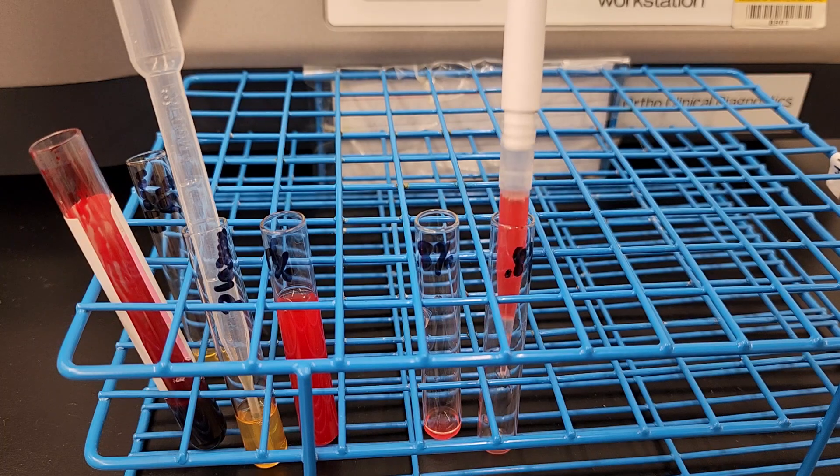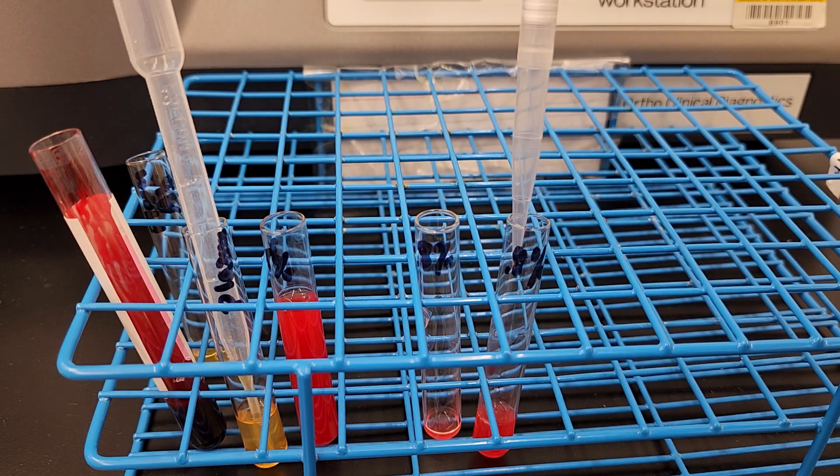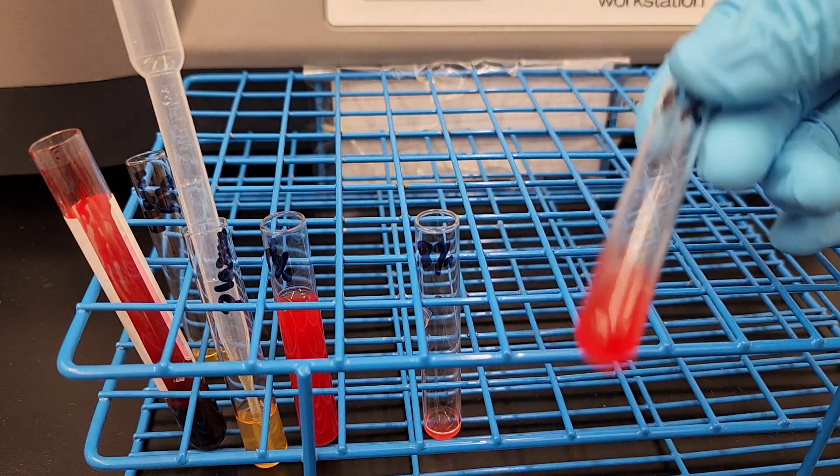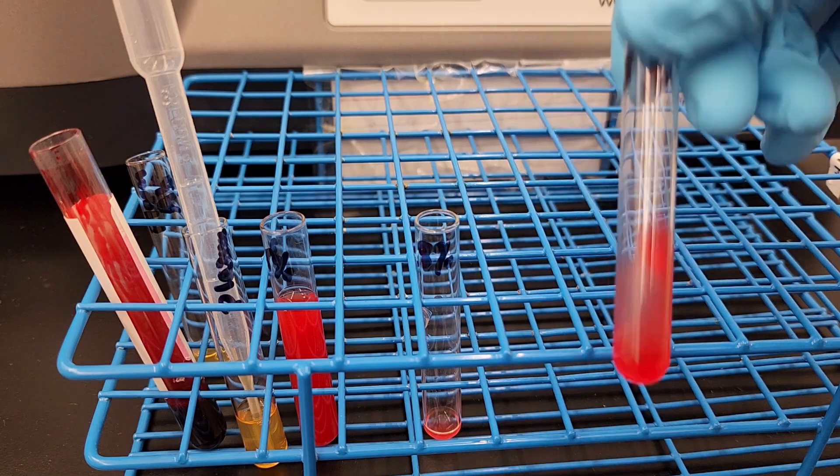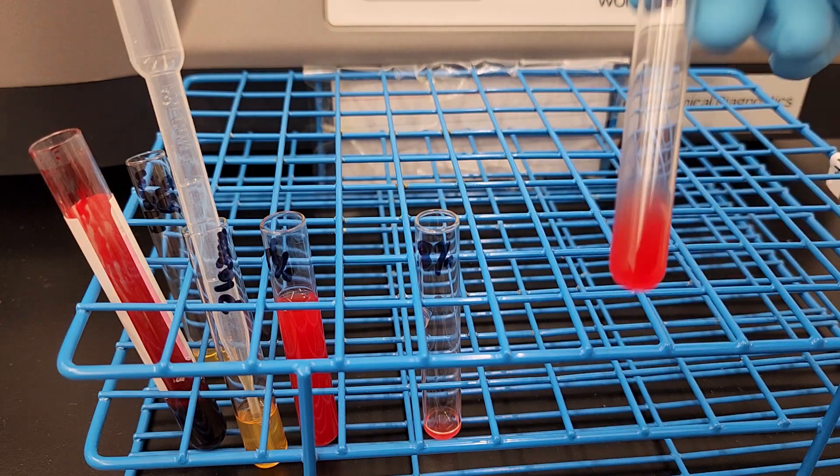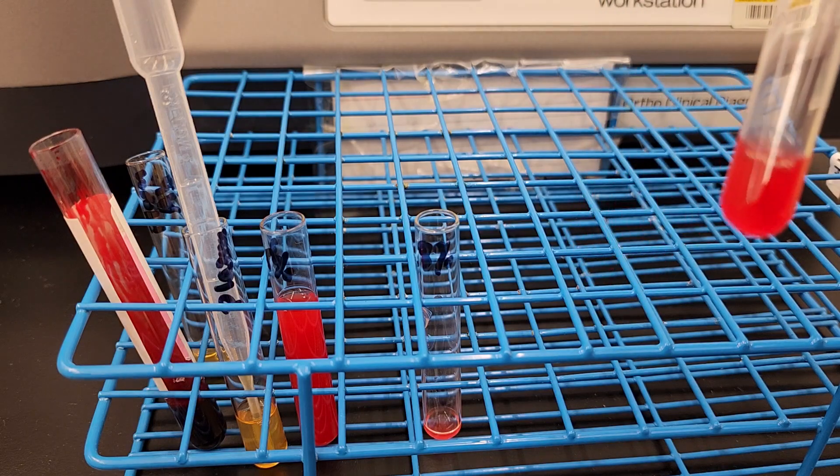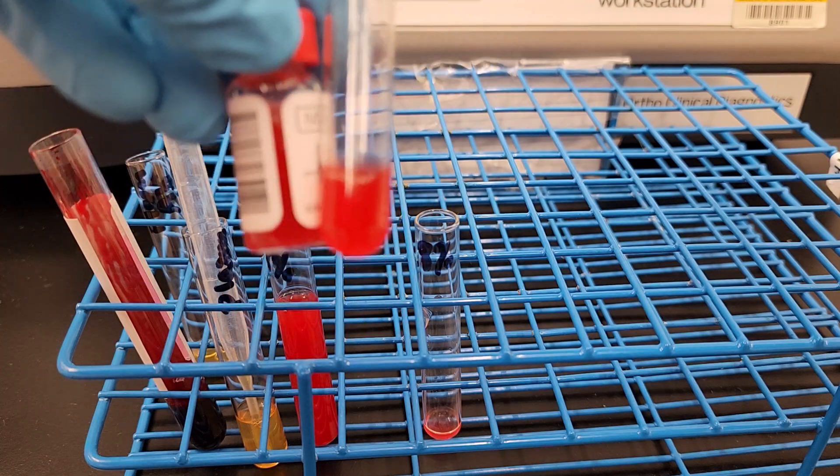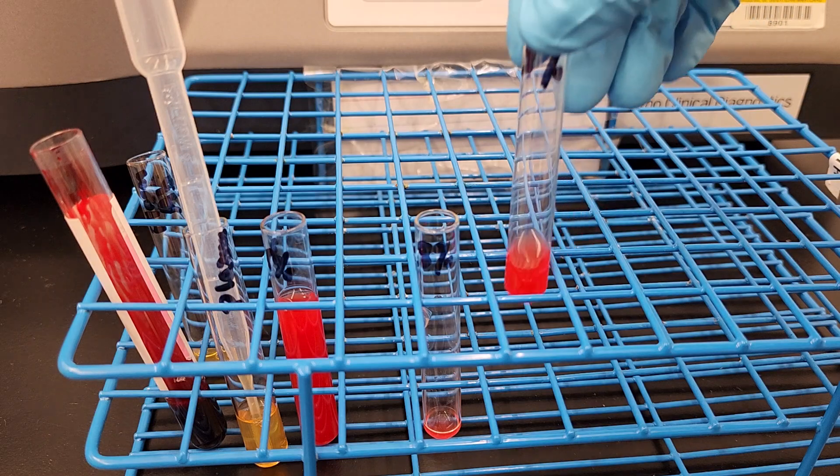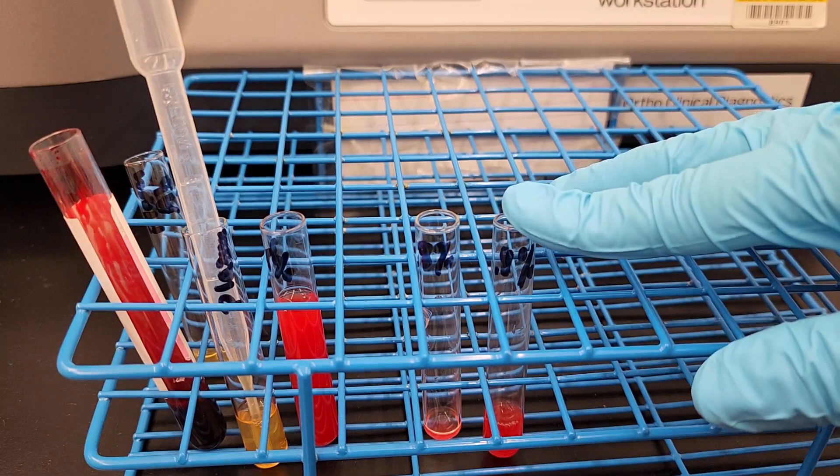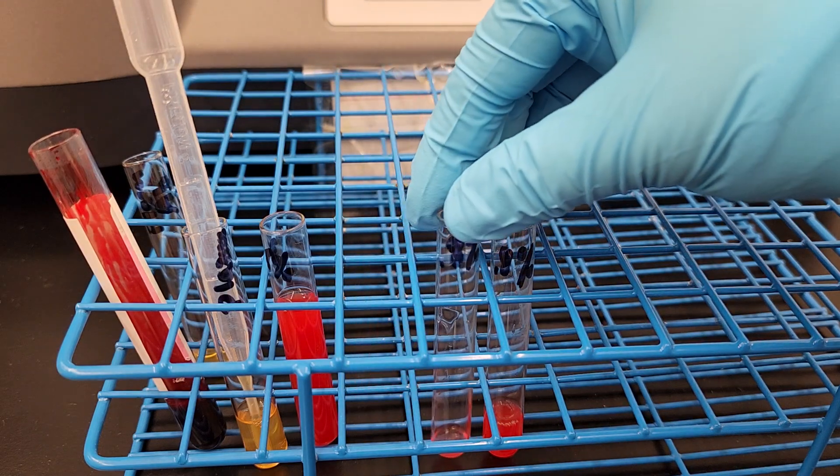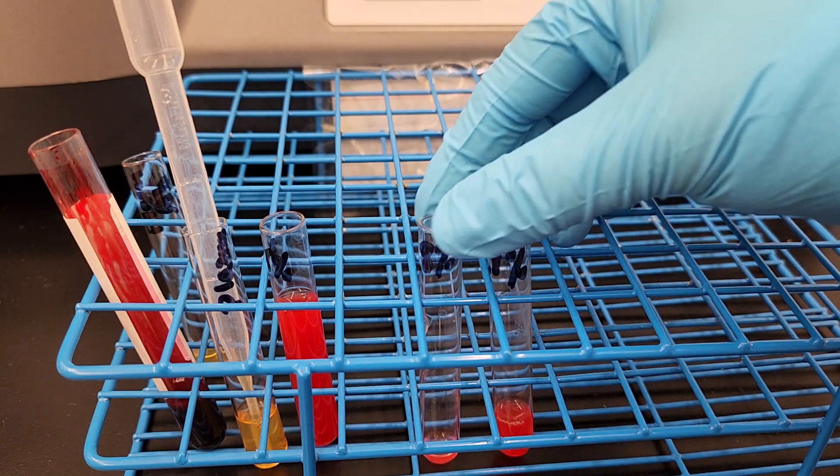Okay, so for pure volume, this is more beneficial to use because you get more bang for your buck out of making the red cell suspension. All right. Get that off of the back. I didn't see that part. So here, let's take a look. Okay, that looks like that matches. All right. So we absolutely will get more volume if we do it from the original specimen. If you don't need as much of a volume, you could always do it from the 3 to 5%. Either way works out.